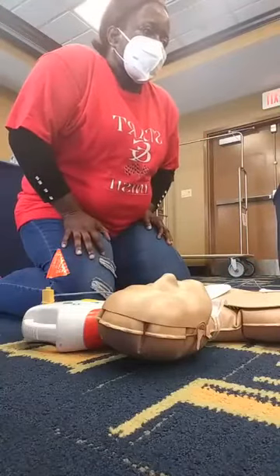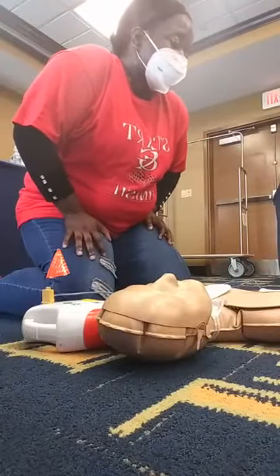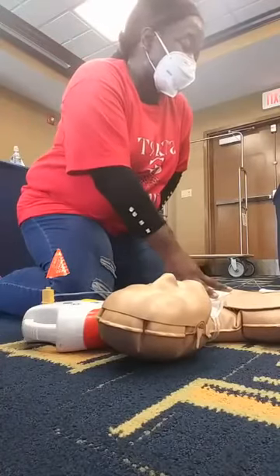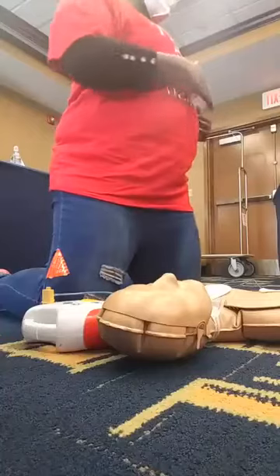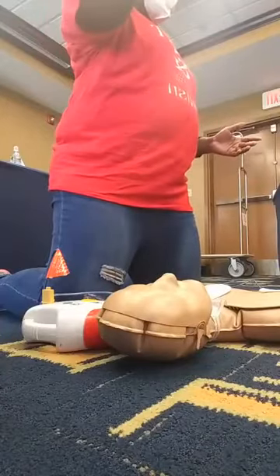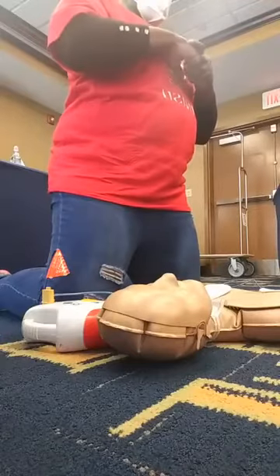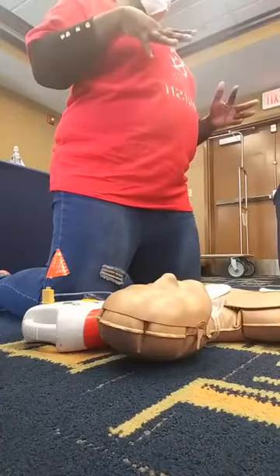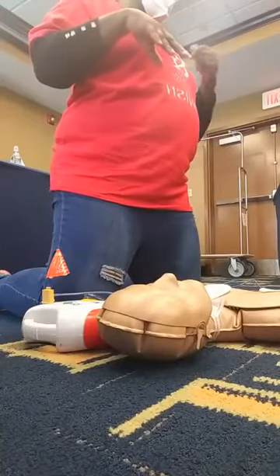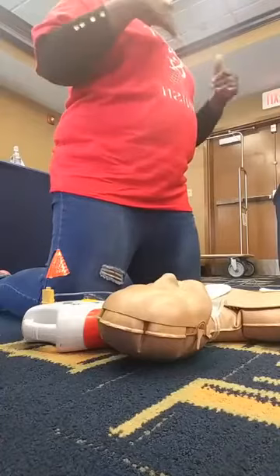Also, if they have a pacemaker, you don't want to place the pad directly over the pacemaker, but maybe to the side or under it. Most of the time, a pacemaker is going to be on the left side instead of the right side. Also, if they have any surgical incisions, you don't want to place the pad directly over the incision, but anywhere around it.